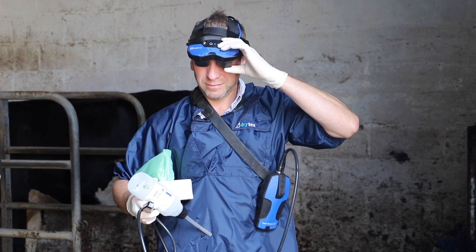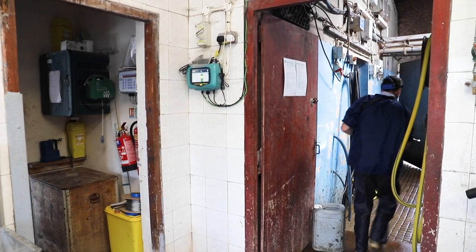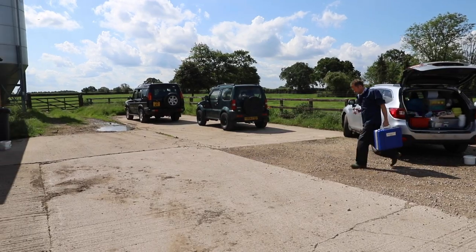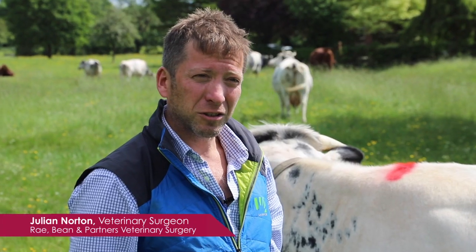The Easy Scan Go is a really fantastic piece of equipment and it's really found a home in our practice. Alan and myself do most of the scanning and we're kind of fighting over the scanner for the visits. It takes up no space back at the practice and it's easy to charge up the batteries, so it works really well — we're really happy with it.